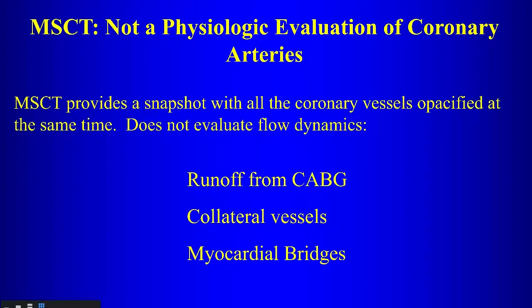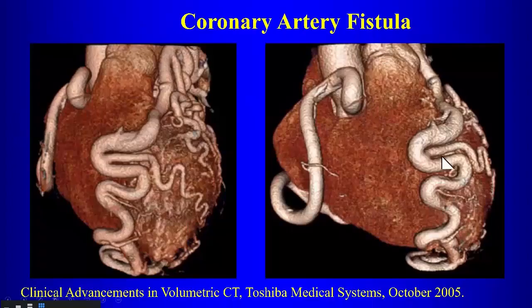Whereas if they're doing a cardiac cath, they're actually looking at the flow dynamics as the contrast goes through the vessels. They can look at collateral vessels, they can look at AV fistulas in terms of, how do those fistulas fill? So that can be a limitation.